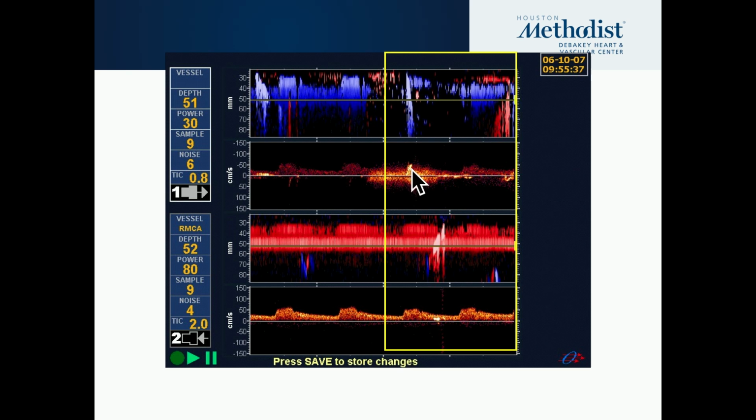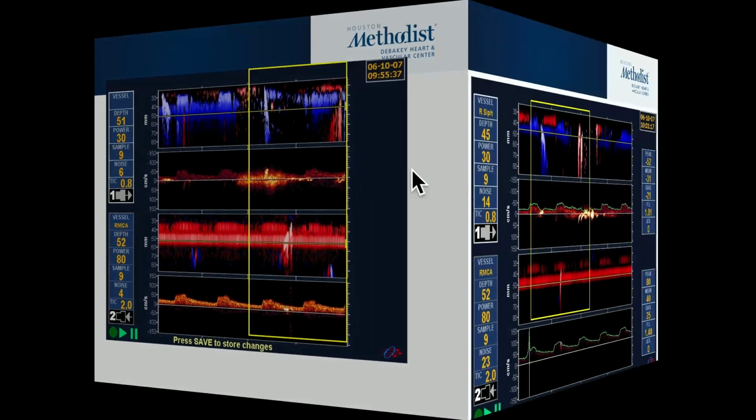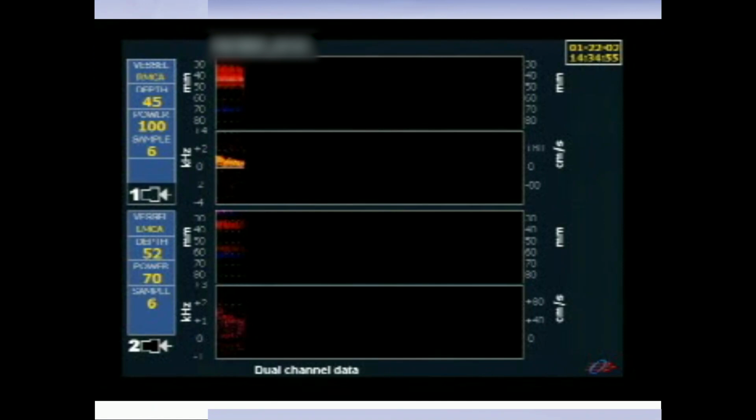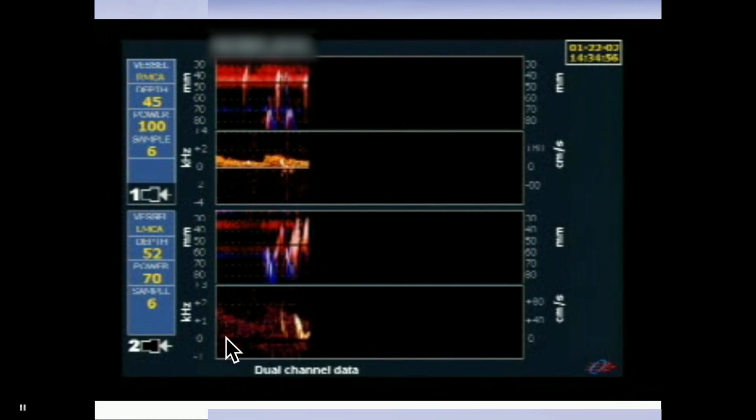There's so much more information in what you see on the speed, more information about the bubbles. Yeah, it's a positive bubble study. In a moment you see any of those white lines, but it's kind of cool to see a little bit more detail of what your ultrasound is telling you. And if you speak this Doppler language and you understand what the ultrasound is telling you, you're good. So here's one more.